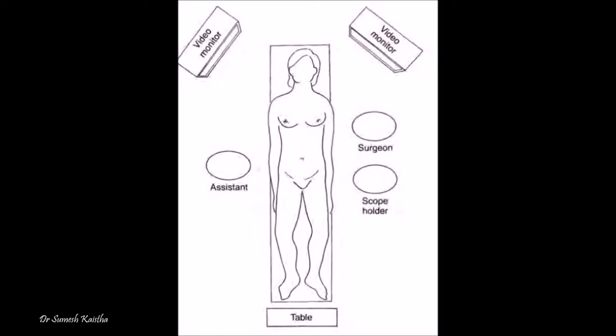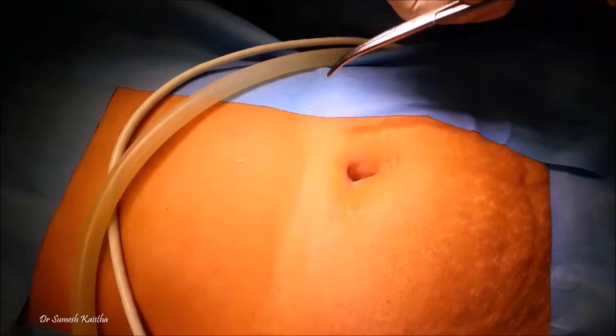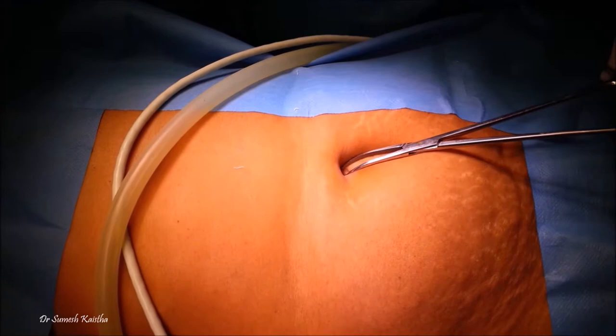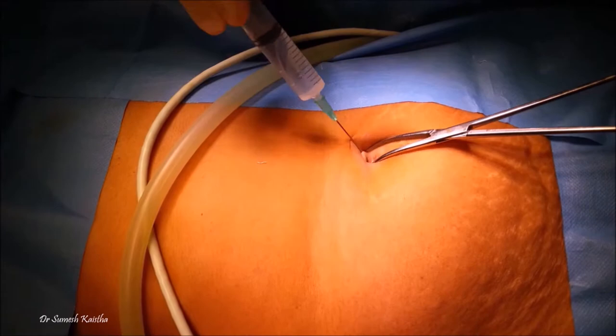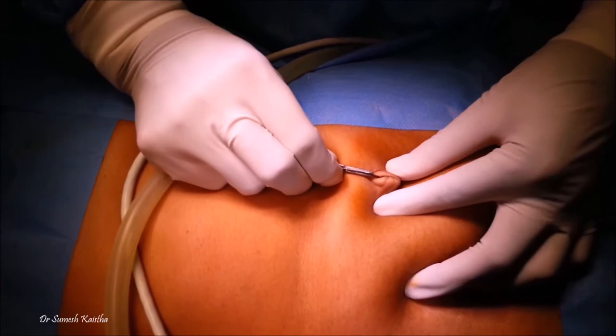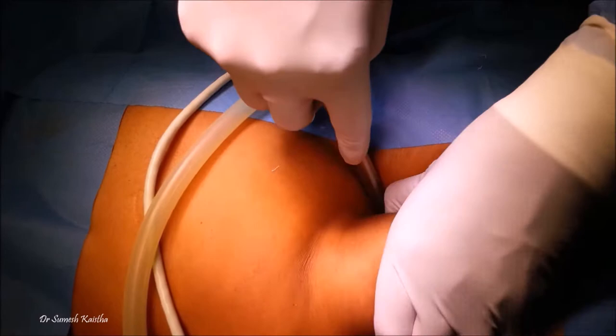Patient is placed in supine position under general anesthesia and this is the team setup. A 10 millimeter port is inserted through the umbilicus using direct trocar insertion. Many surgeons use open technique or various needle or optical port depending on individual choice.